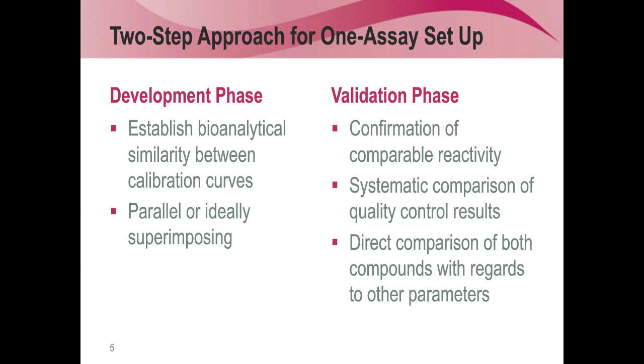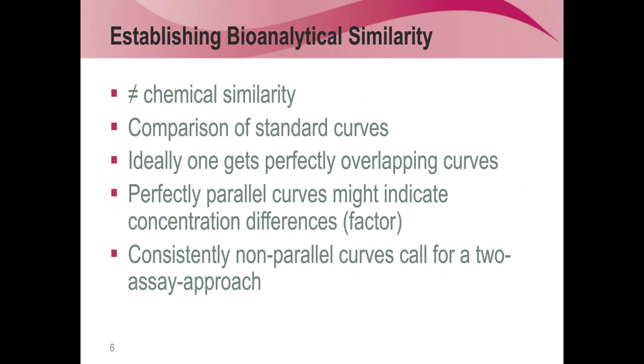So again, let me be clear that bioanalytical similarity is not chemical similarity. Of course, you usually have a wide array of biophysical methods to characterize your proteins. This is something we cannot really do. We have a detection antibody and a capture antibody, and they are essentially only reporting on that moiety where they are binding. Of course, we can try several ones, but there is a clear distinction between the types of similarity.